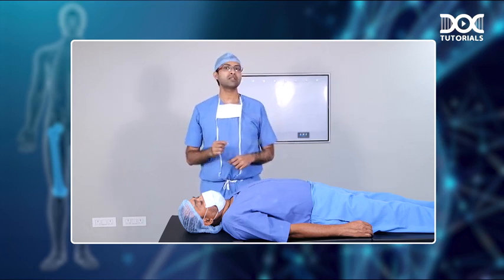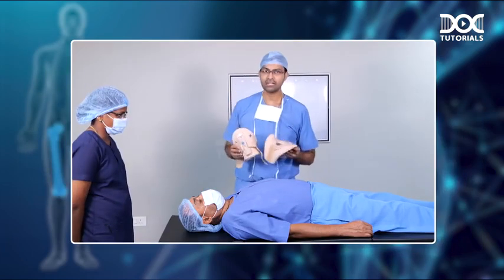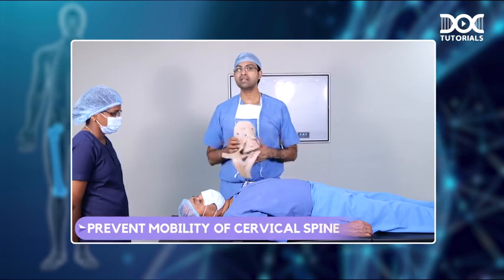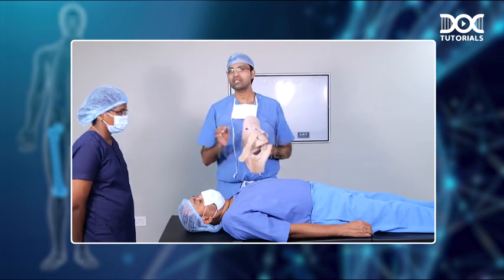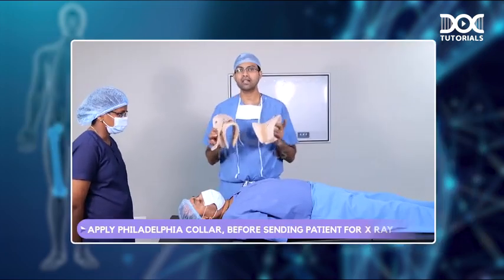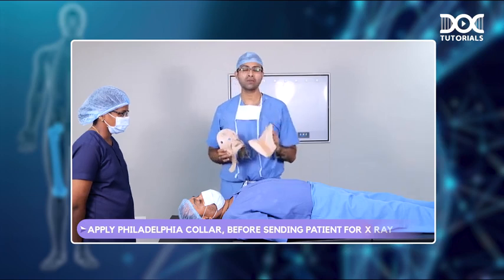So we will first take a look at the Philadelphia collar. So what is this Philadelphia collar? It is a rigid cervical brace which we use for preventing the mobility of the cervical spine. For any patient in whom you are suspecting a cervical spine injury, you must apply the Philadelphia collar before you send the patient for an X-ray. This is very, very important.